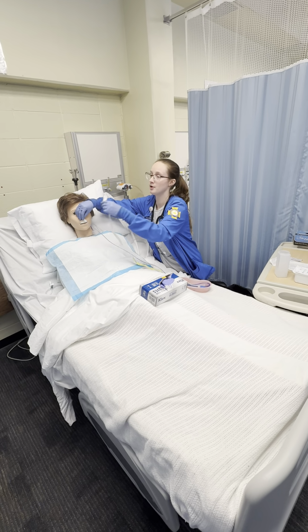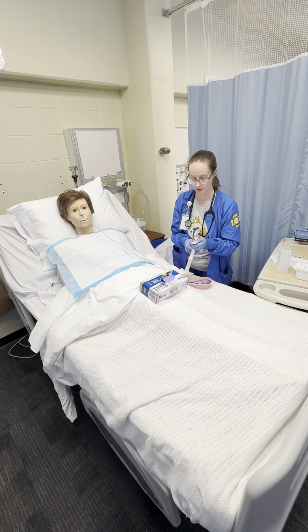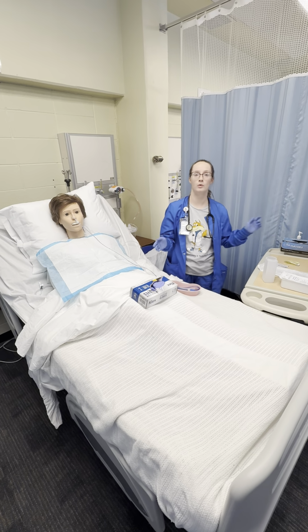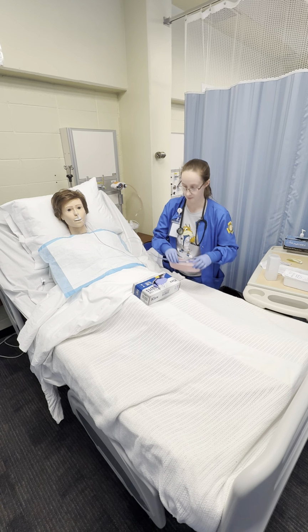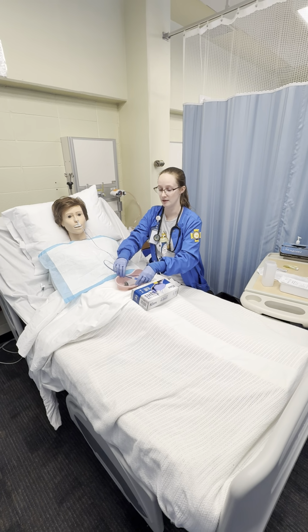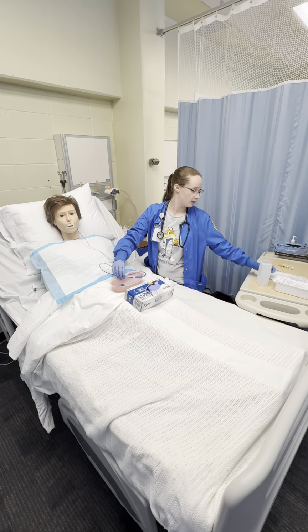And I'm going to take my marker and reinforce that marking I made earlier, right here up at the nostril. And we would want to hook it up to a suction machine or per order on any kind of machine that may be ordered, but we have no orders for a machine right now.